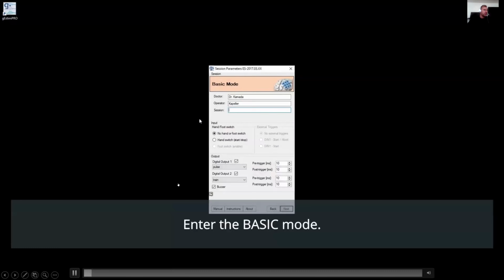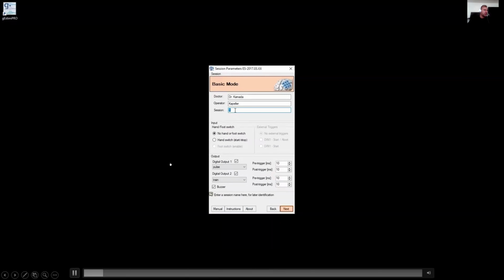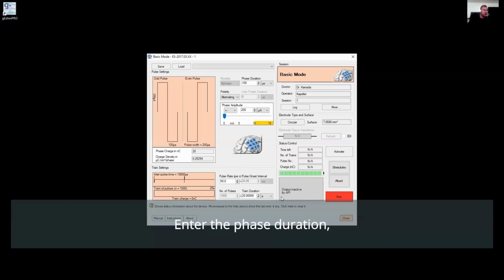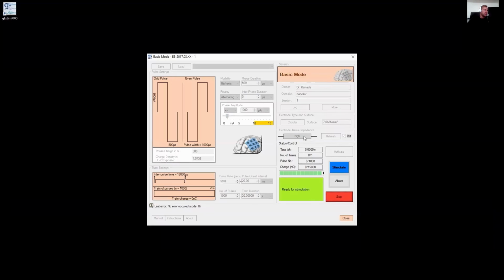So how does this look when we perform the stimulation with the device? So this is the basic control software, and here we can now set a stimulation session. Important is that we have a stimulation output trigger as well, so we can communicate with other devices like the amplifier, and here set the trigger of the stimulation event as a marker, and then, for example, we can trigger based on the stimulation pulses and see how the waveform of the EEG changes.